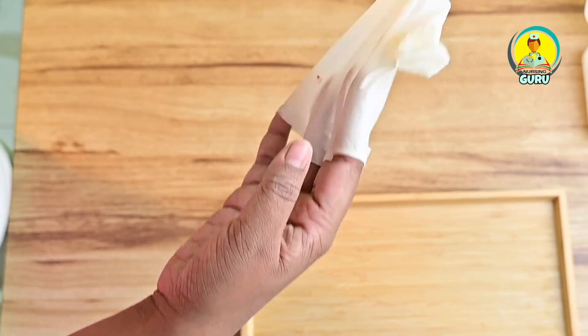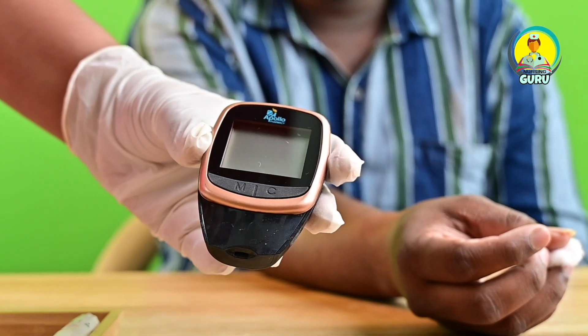Record the values and inform the patient. This is all about the procedure.